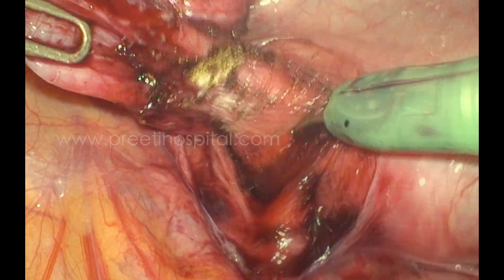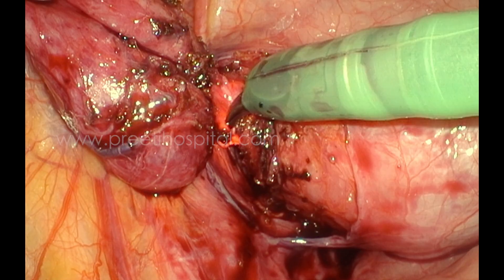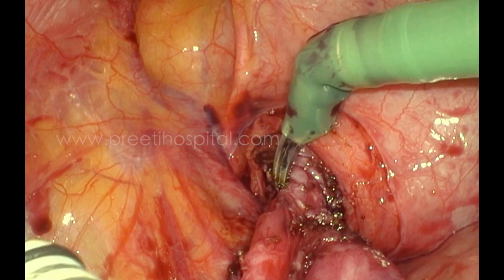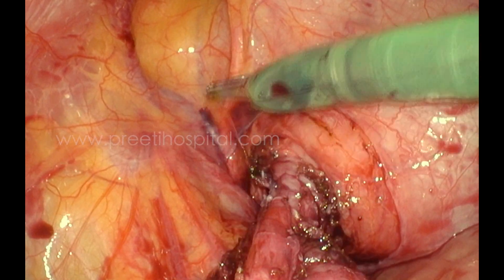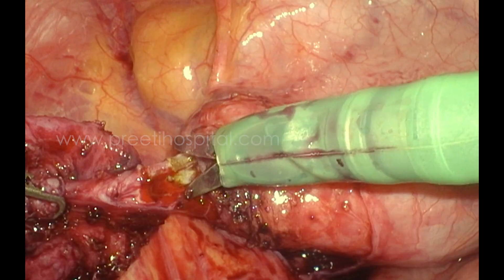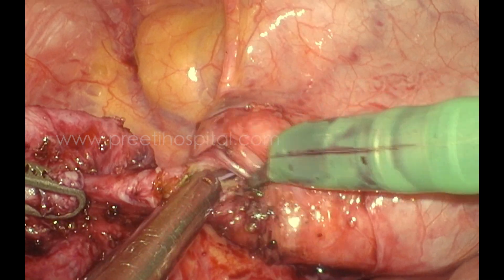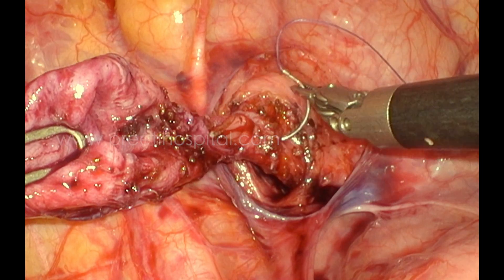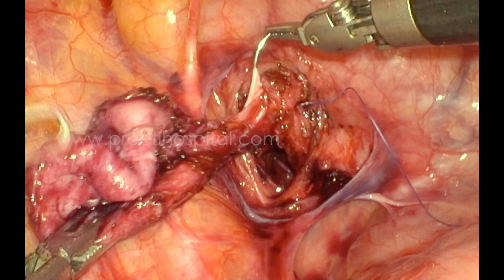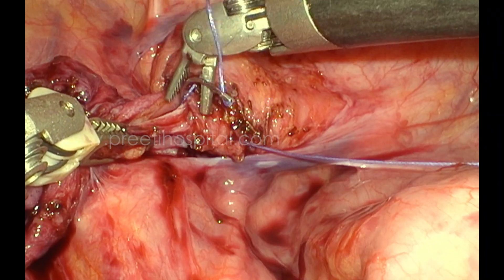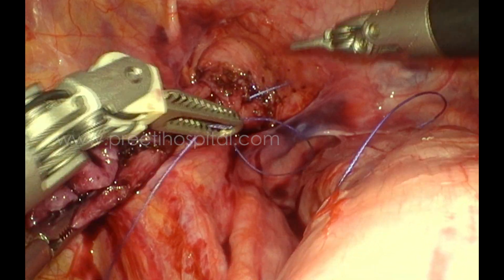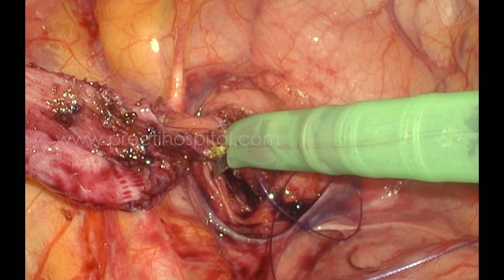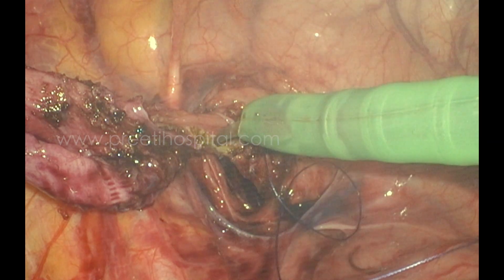Before opening, we inserted the ureteroscope — you can appreciate the neck of the diverticulum. After taking an initial suture, we opened anteriorly first, identifying the mucosa exactly at the mouth. Using 3-0 Vicryl — we considered V-lock but it was not necessary for this small area in a child — we took a proper angle bite, then cut the remaining half and took additional bites before complete excision to use it as traction.